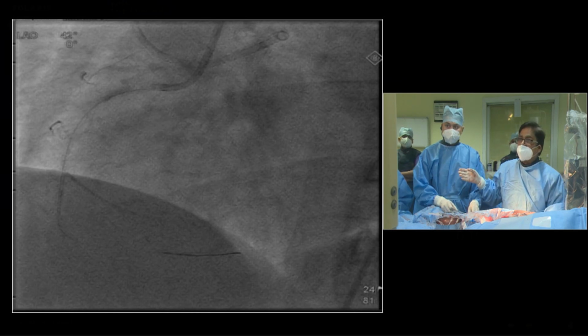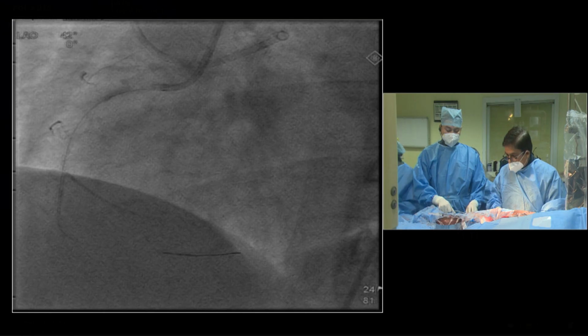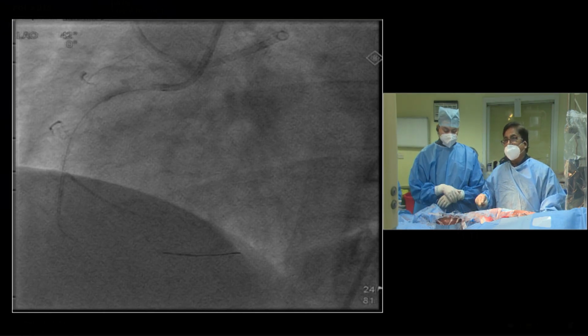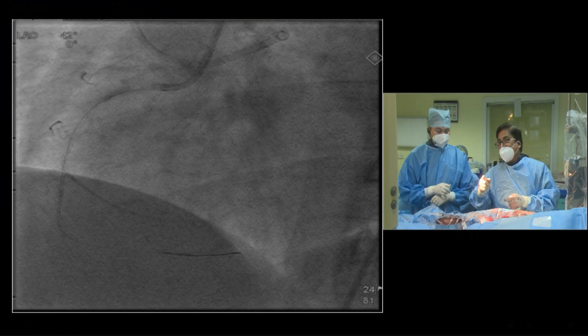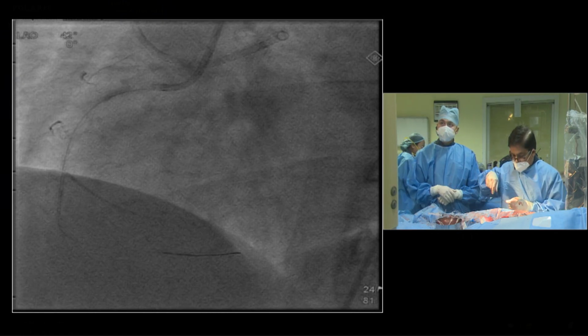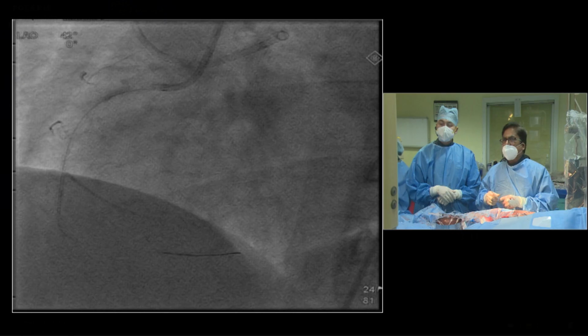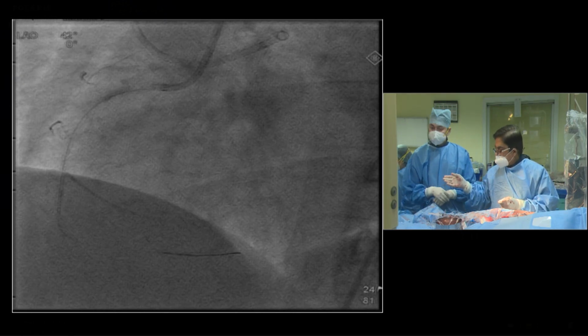Last time, I need a 2.5 balloon. Correct. 2.5 to dilate the proximal cap, and then when I need to wire the distal vessel, I might use a Crusade. You see, that is the same thing. Ideally, a Crusade to take, but the proximal vessel to be dilated first. Then yes, wait for the Crusade. 2.5, please. Come on. Proximal.